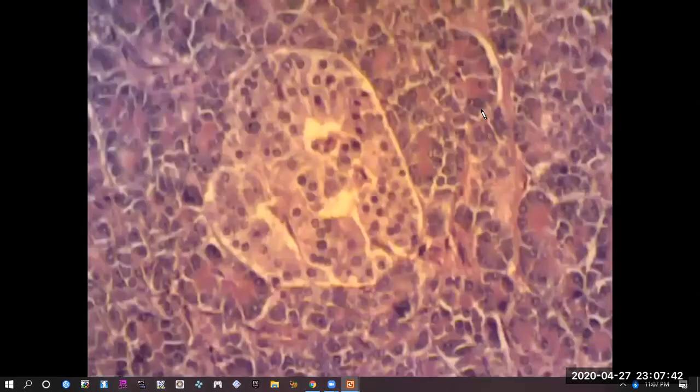And the last sample, another accessory organ, the pancreas. And the pancreas has a collection of generally two types of areas. We can see all of this area here, and you notice the cells have a lighter stain to their cytoplasm. This entire area is known as a pancreatic islet, as opposed to, you notice the darker majority of the tissue. So the cells that make up the majority of the pancreatic tissue with a darker stain to the cytoplasm.